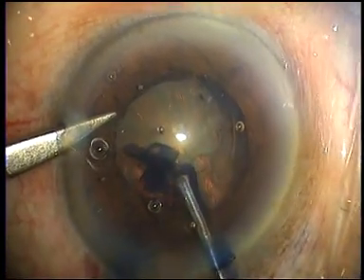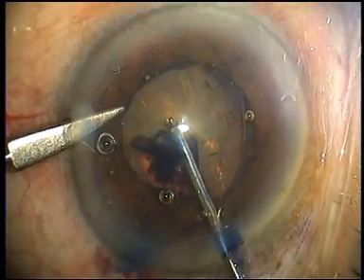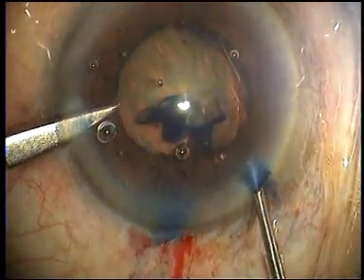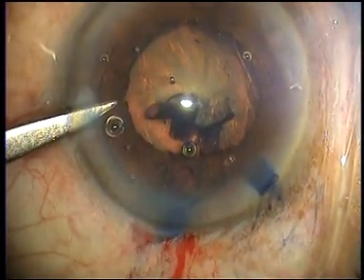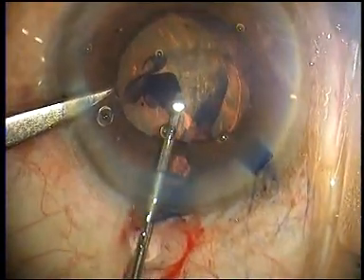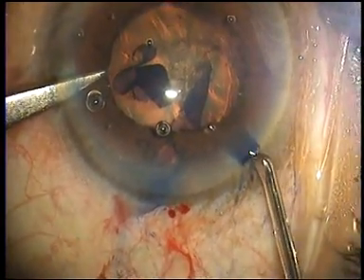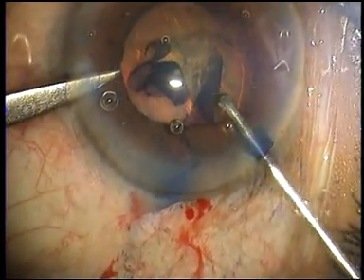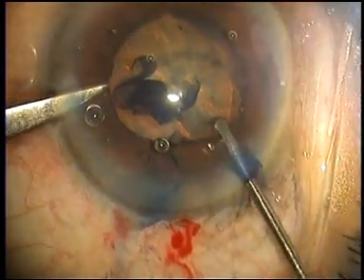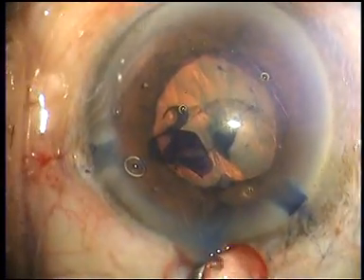If the anterior chamber collapses and the rhexis becomes difficult to do, do not hesitate to fill the anterior chamber with viscoelastic and continue your rhexis as before. You will see here that the anterior chamber is shallowing and the rhexis is not proceeding according to plan, so we fill up the anterior chamber with viscoelastic, put the anterior capsule on stretch, and then in a few moments finish the capsular rhexis — now round and intact along the full circumference of its periphery.